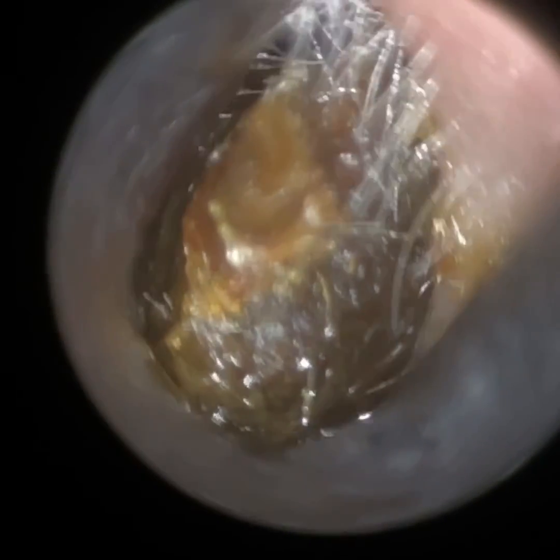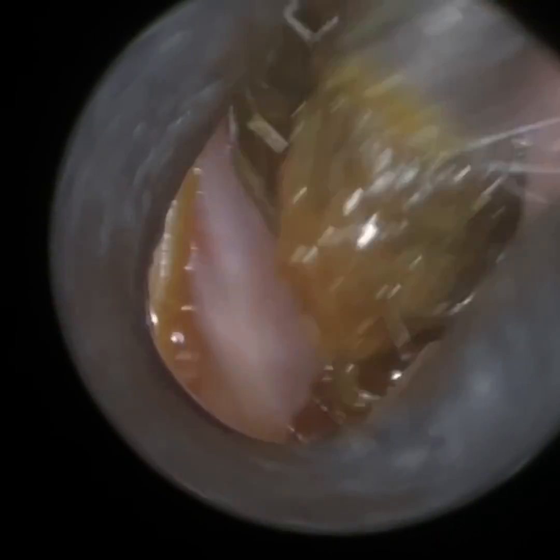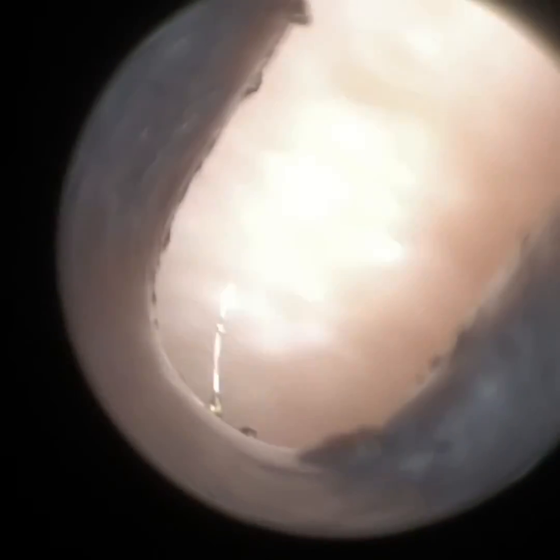Going back to this particular case — we've been trying to tease this wax out. It's really hard and the entrance is really narrow. Despite my best efforts at stretching the ear canal open, it's still too large a plug, and it's actually lodged. You can probably see in the distance further into the ear canal that the wax plug extends all the way. We just have to use a hook. What's great about the Waxscope is that it's accessible to all ENT micro-instruments. You can see how I'm inserting the St. Bart's ear hook, manipulating this plug of wax and slowly but surely bringing it forwards.